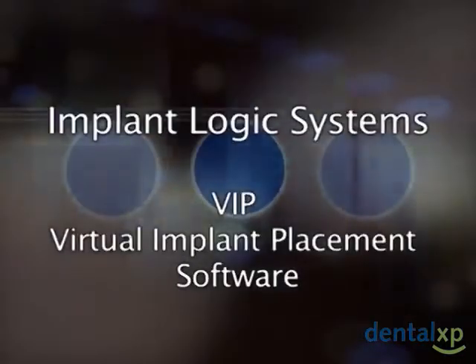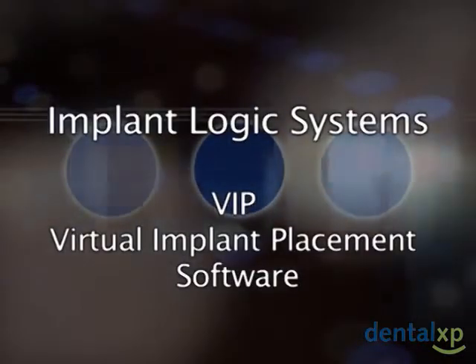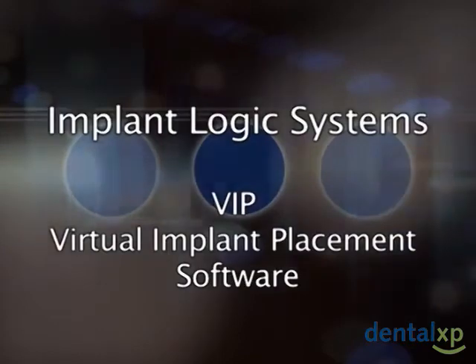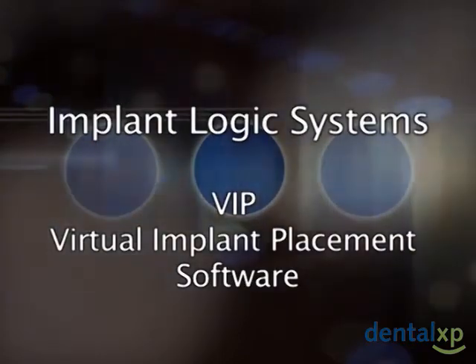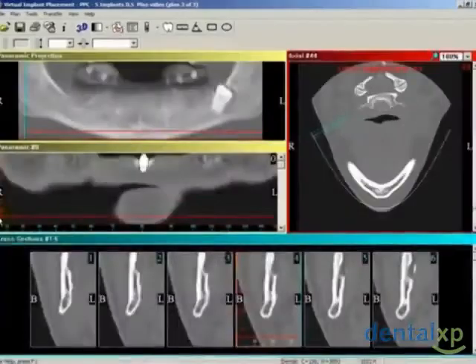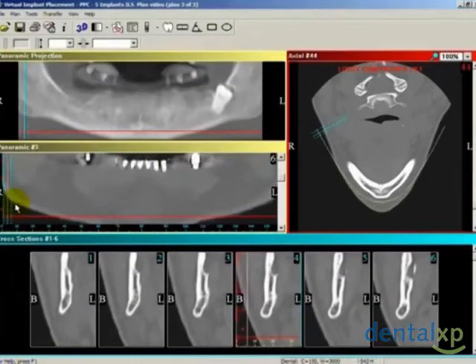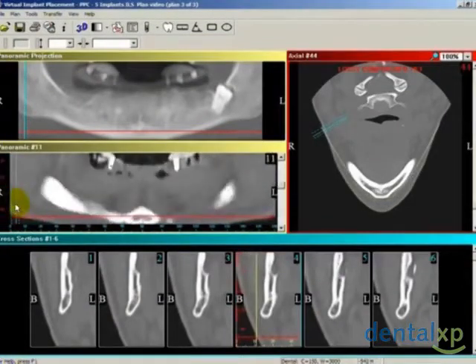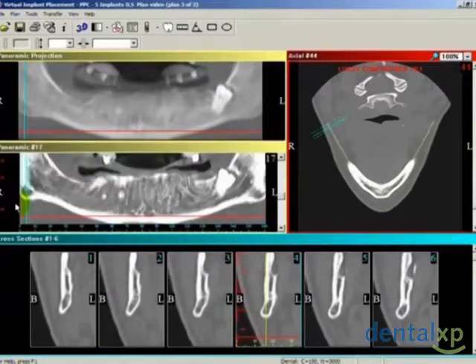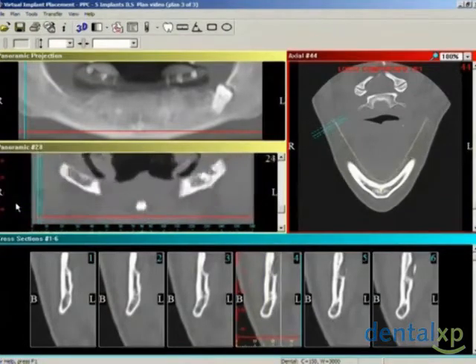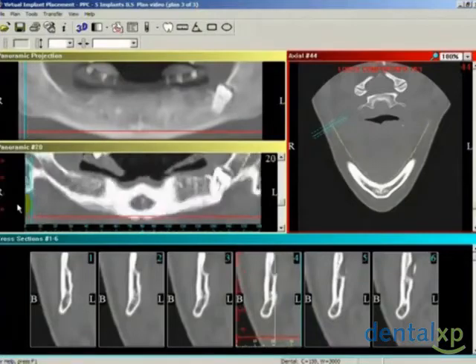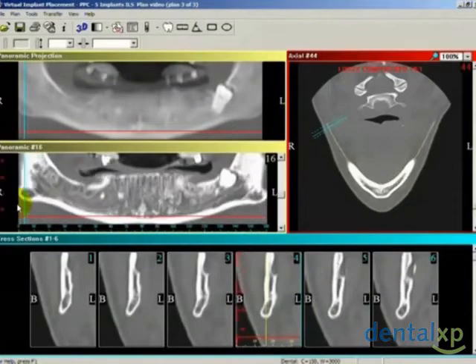In this segment, we will demonstrate the use of the ImplantLogic System software to treatment plan the implant selection and surgical placement for Patricia's case. The program allows the user to scroll through the individual slices. The panoramic series contains the vertical CT slices going from the front of the mouth to the back of the mouth.